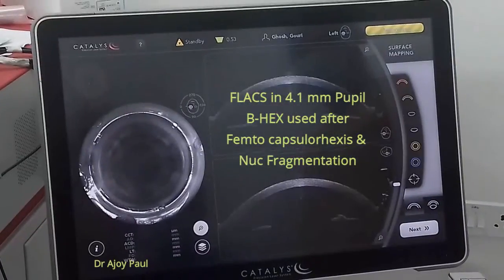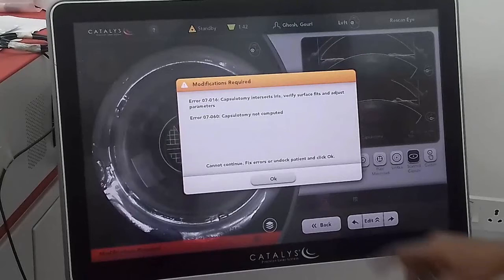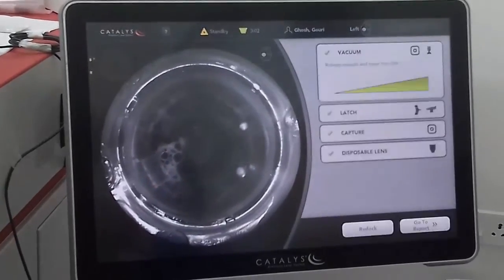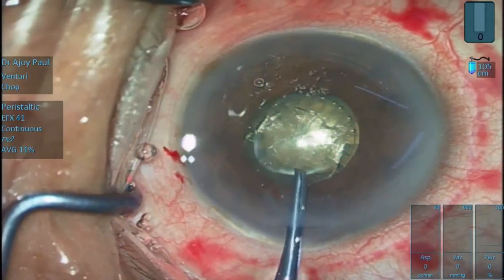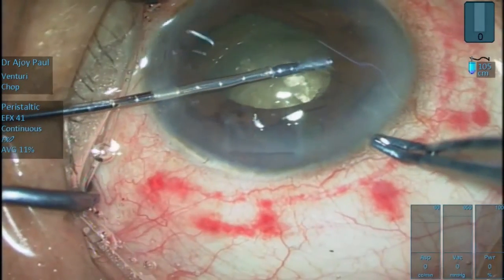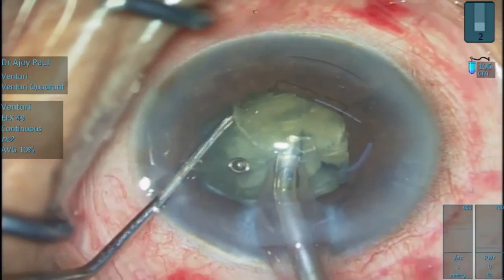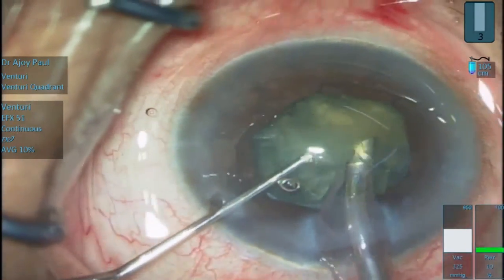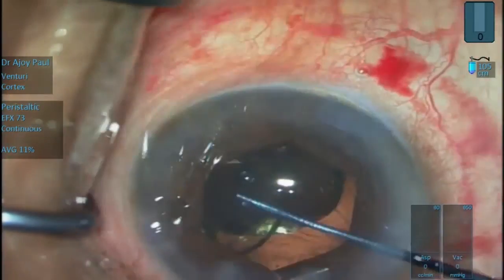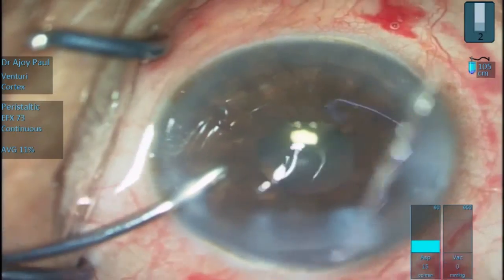Here, femto capsulotomy and nuclear fragmentation is done with a 4.1 mm pupil. An error shows up because the capsulotomy intersects the iris and an adjustment has to be made to the capsulotomy size; now the femto treatment is completed uneventfully. The free capsular flap comes out easily but the pupil is too small for safe phacoemulsification, so a BHEX pupil expander is used. As the alternate flanges are tucked, the capsulorrhexis is safe because of the uniplanar design of the BHEX. Despite the small capsulorrhexis size, phacoemulsification is now much safer and easier. IOL implantation is under such clear visualization, removal is so easy, and we have a wonderful round pupil at the end of surgery.